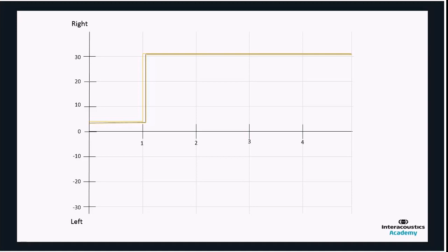During this assessment, we often can take the time to check that the patient is just eliciting an eye movement and not a head movement, as it's very tempting for a patient, when looking right or left, to slightly move their head. Now that will have an effect in terms of where the eye position is, and they then may make corrective eye movements to reposition their eye. This can again be seen in the trace, and a reinstruction can be offered and some mental alerting tasking if needed to keep them in the correct position for the eye examination.